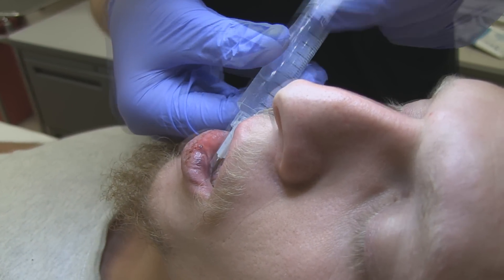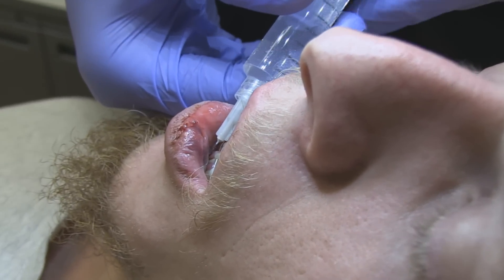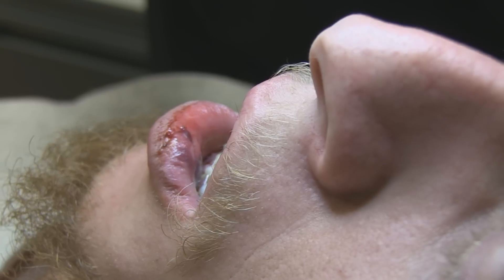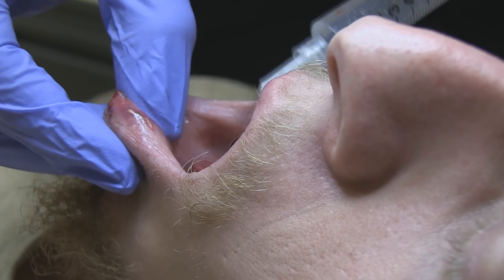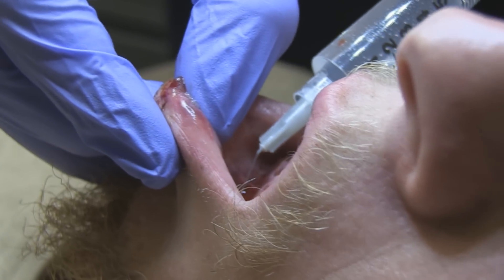How much are you injecting in there? About 3 cc's, which is the recommended amount in Robertson Hedges. That was only about 1.5 cc's, so we can do one more. Have you felt any numbing so far? No.